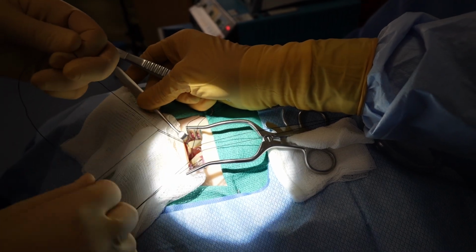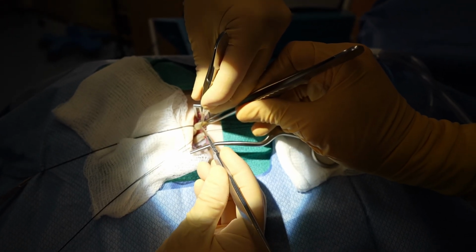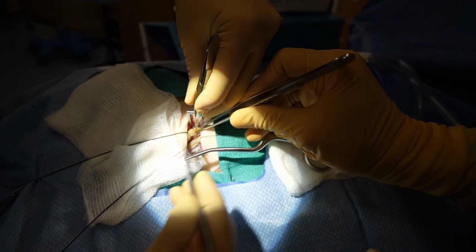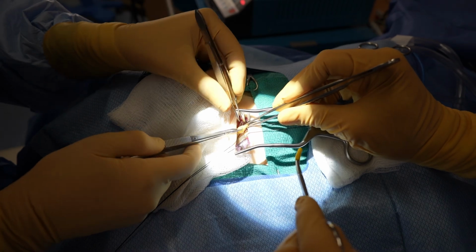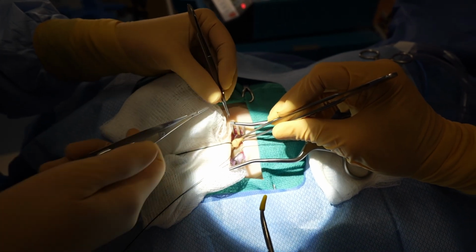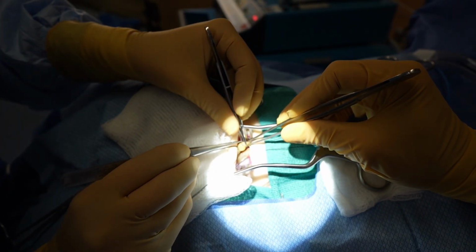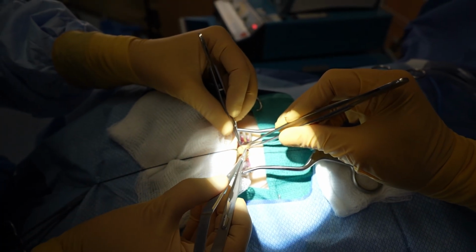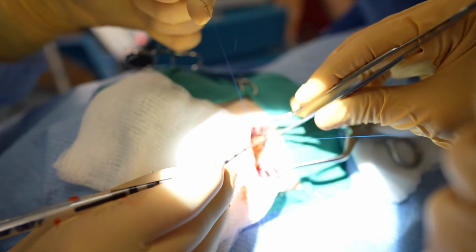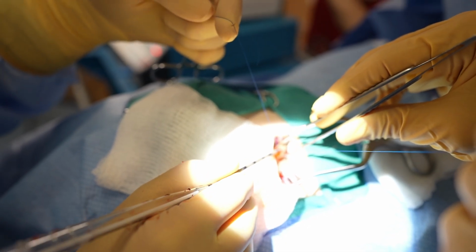First, we tie off the cranial side of the artery and place a snap on it to place tension. We then control the vessel on the cardiac side and perform an arteriotomy using an 11-blade scalpel transversely through the vessel down about halfway. Next, we place 2 Prolene sutures through the anterior wall of the vessel in order to help avoid dissection of the vessel as we place the cannula. Now we very carefully place our arterial cannula down 2 to 3 centimeters while controlling the cardiac side of the vessel.